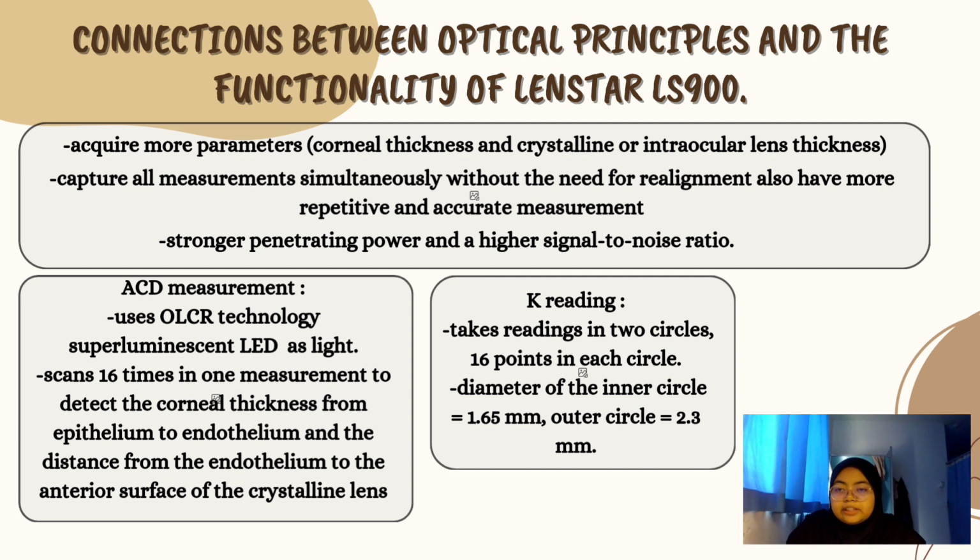The OLCR used with the Lenstar has a stronger penetrating power and a higher signal-to-noise ratio. For the anterior chamber depth measurement, the Lenstar uses OLCR technology to scan 16 times in one measurement to detect the cornea thickness from epithelium to endothelium and the distance from the endothelium to the anterior surface of the crystalline lens.